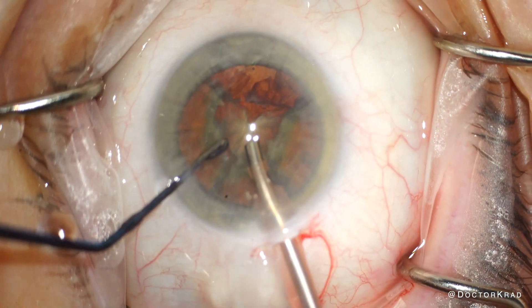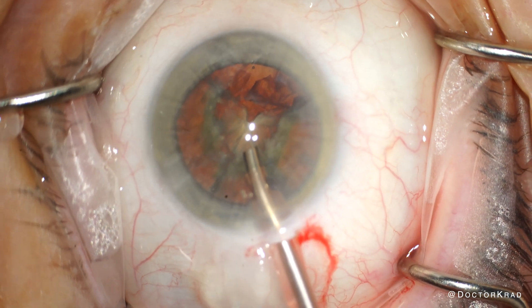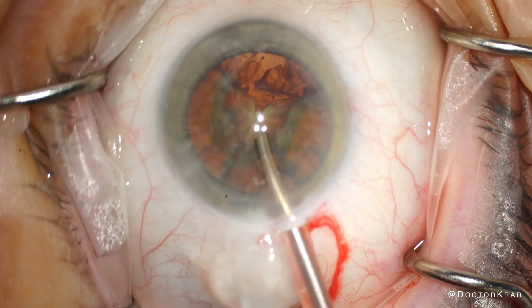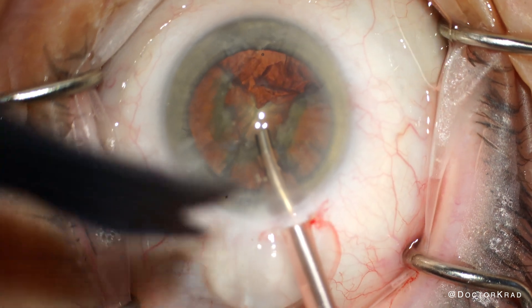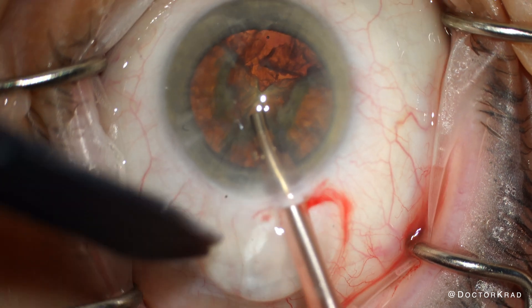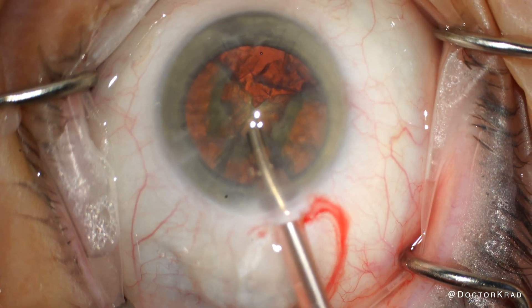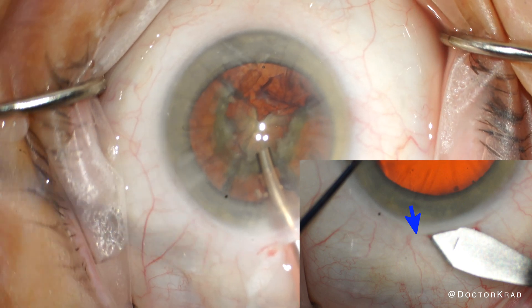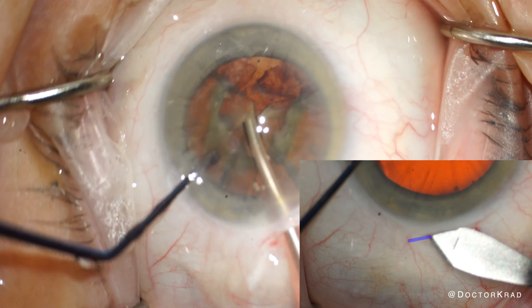And because a large conjunctival peritomy was not made, there is a risk of chemosis, or conjunctival swelling, at the incision site. If you see this, a little snip with scissors will resolve it, and the earlier this is performed the better. This could have been prevented if I made a wider groove through the conjunctiva on the left side of my incision from the very beginning.